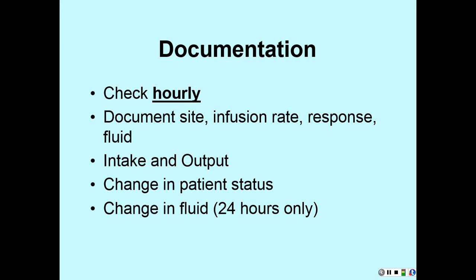If it's on a pump and they're changing levels, then they just zero it out. And they'll still tell you there's about 300 in there. You can count 300, but your pump is keeping up with it. So at the end of your shift, you're going to go in there and zero it out and see how much has infused since you got that patient back from surgery. Okay? Yes, ma'am.